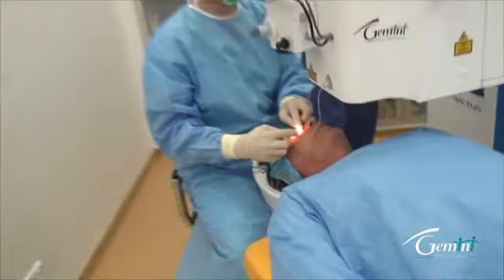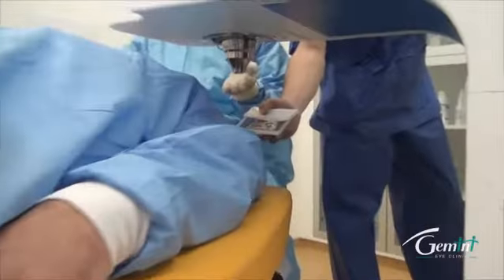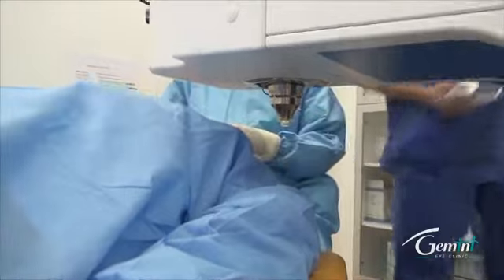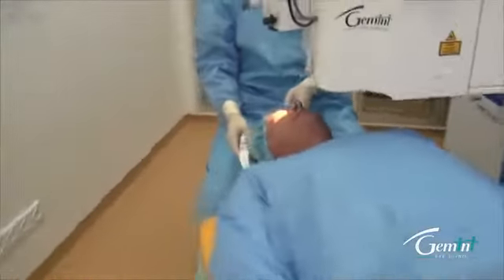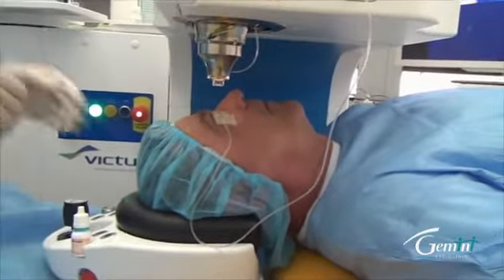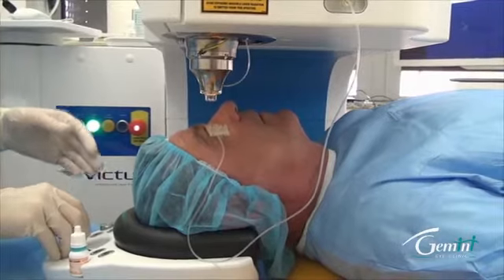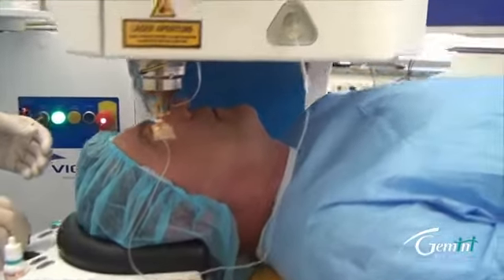It's a soft suction ring with silicone edge. We apply the suction, and then after a while we have the patient interface ready to be attached to the cone of the femtosecond laser. And the next step is to move the patient under the laser, so we can start the docking procedure, and we'll just bring the patient toward the laser and just look straight into the middle.